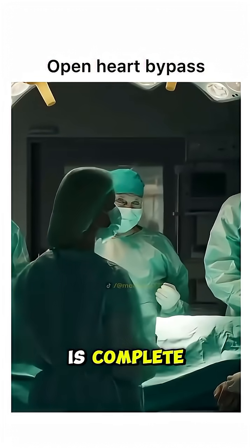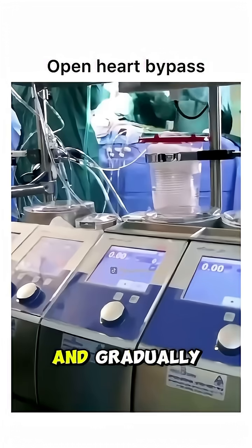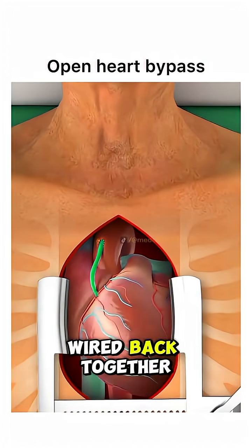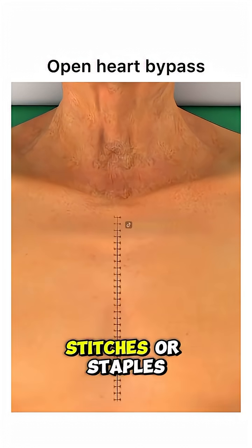Once the bypass is complete, the surgeon restarts the heart and gradually takes the patient off the heart-lung machine. The breastbone is wired back together, and the chest is closed with stitches or staples.